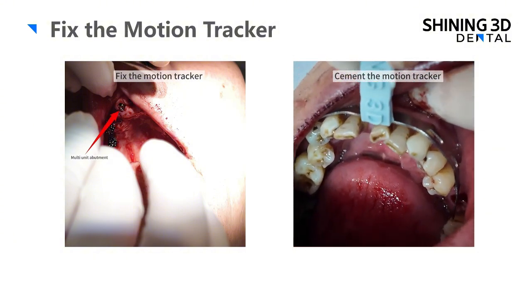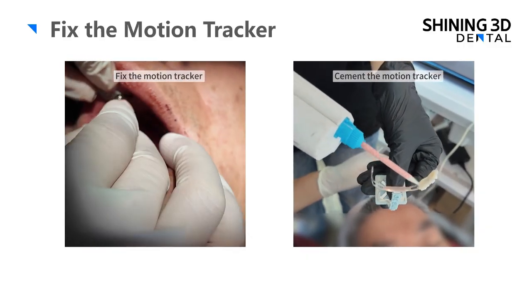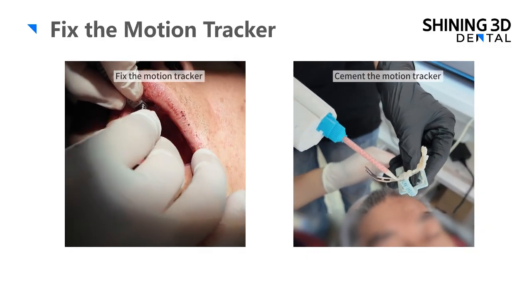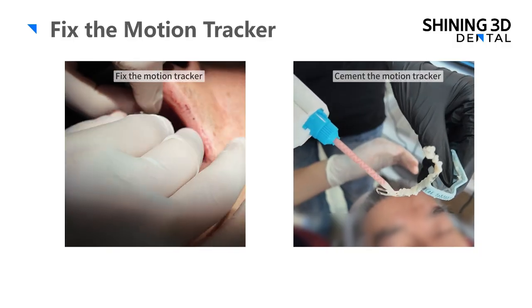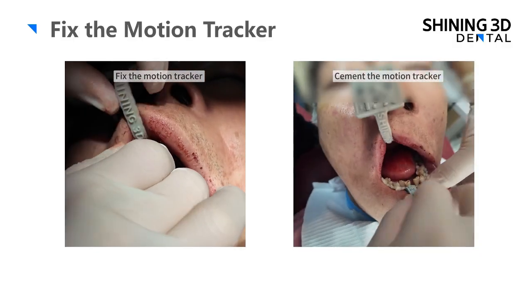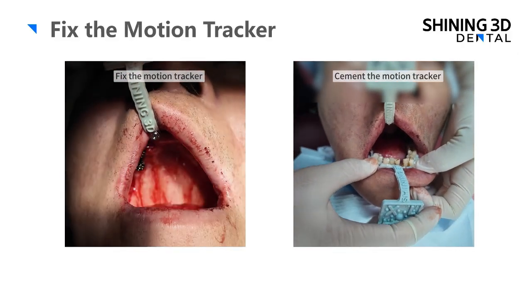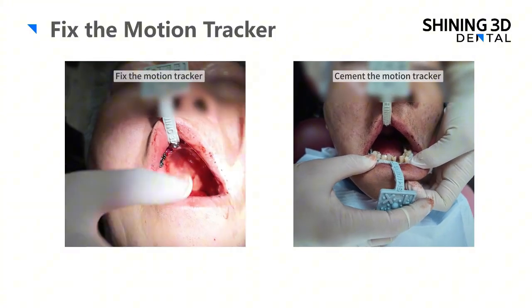This page shows how to fix the motion tracker inside both upper and lower jaw. For the upper jaw, we said that we're going to use the motion tracker using the screw retained for this patient's upper jaw, because it's an immediate loading case and there are MUAs installed for this patient already.